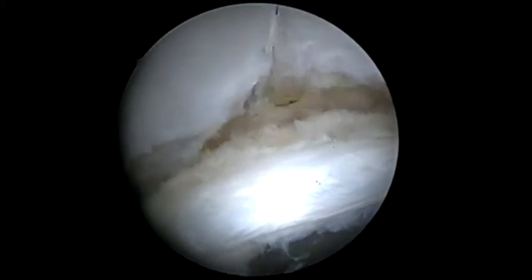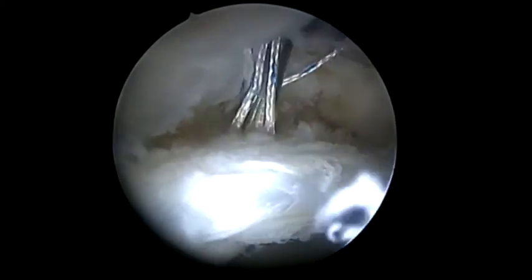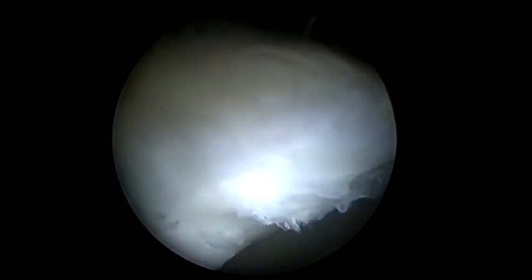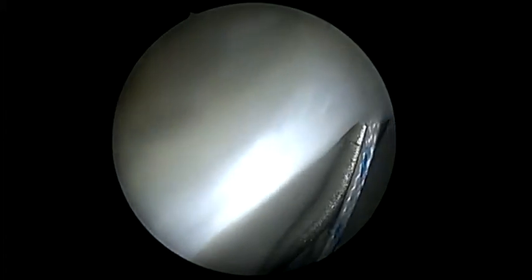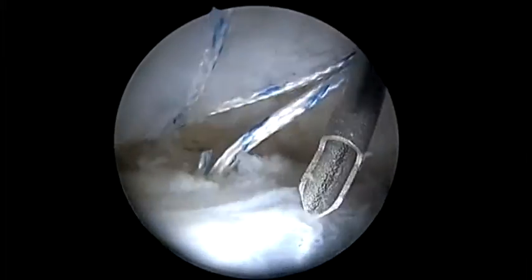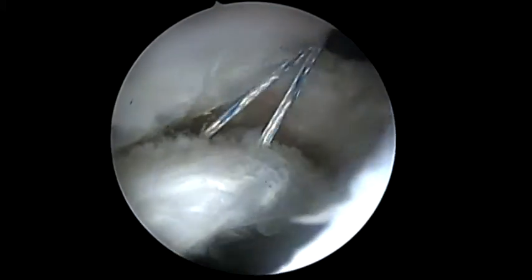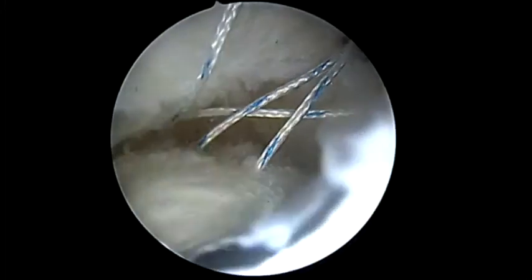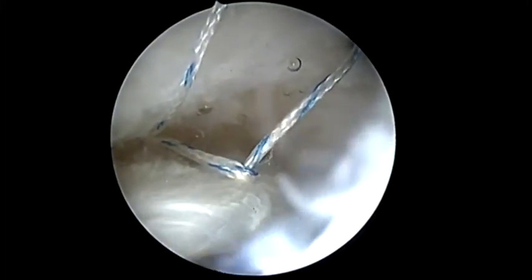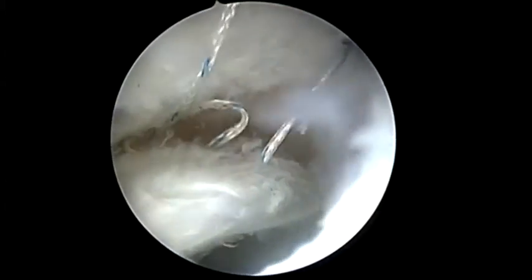The drill guide is then removed and the sutures are passed through the labrum. To facilitate this, a curved suture passer can be very helpful to improve the angle of approach to the labrum. This suture is passed through the delaminated cartilage in a labral base fixation technique or a mattress suture technique. In cases where the sutures are crossed, simply grasping the suture limb exiting from the labrum can uncross the sutures, and then the sutures are easily tied down.